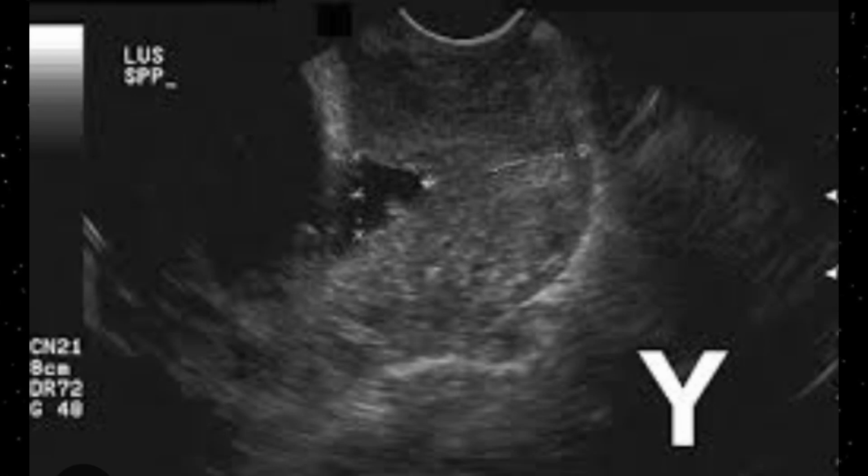So far as the endocervical canal is concerned, it is not yet dilated, so it means it's a mild degree. Here you can appreciate that there may be a mild, moderate, or severe degree. It's best to measure all that. If you keep an eye on all these important anatomical landmarks, you may be able to pick the points whether the case is in a mild, moderate, or severe status. It is always good to mention all these categories because it helps towards the management.